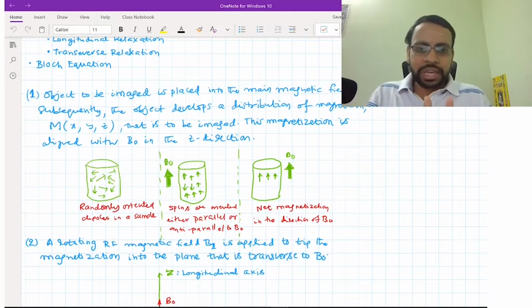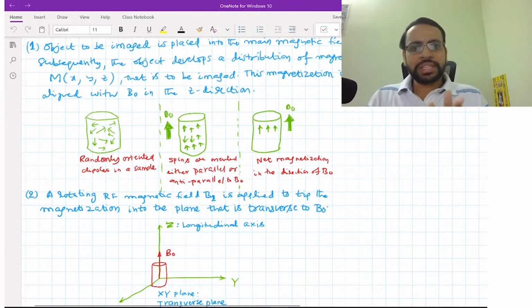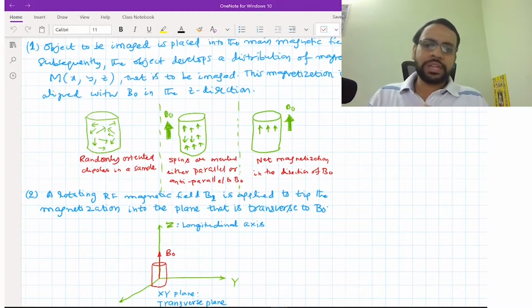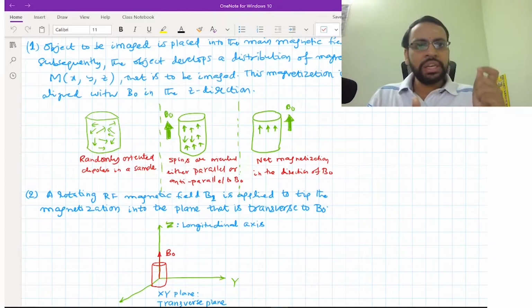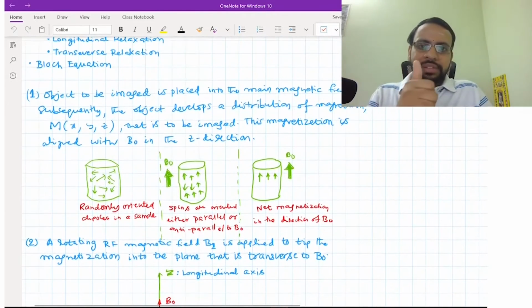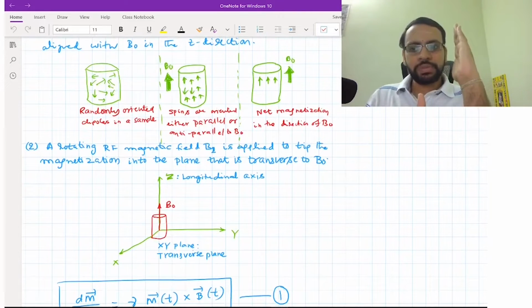For that particular sample or voxel, let's say of the size of millimeters, we also studied how much magnetic field it could give you. For example, under 1 Tesla and room temperature, if you have 2 million spins, about 7 more will align themselves in the direction of the applied magnetic field B naught, and this results in a magnetization vector M bar. Okay, the resulting magnetization vector, let's call it M bar. This is in the direction of B naught.